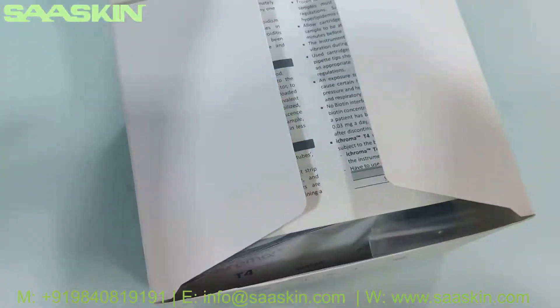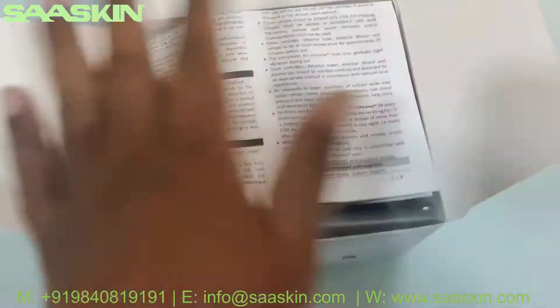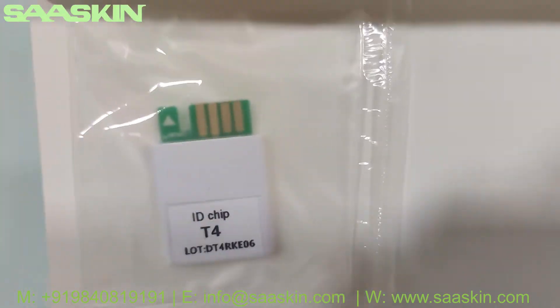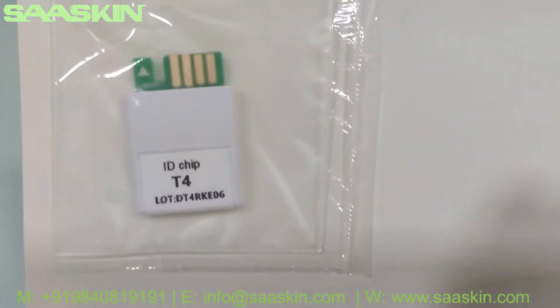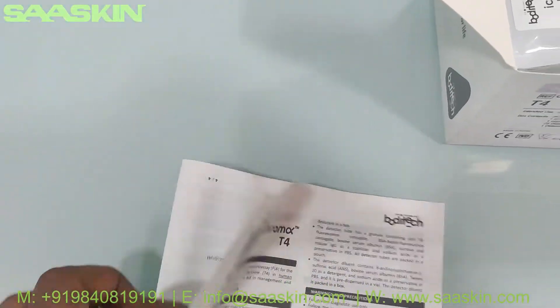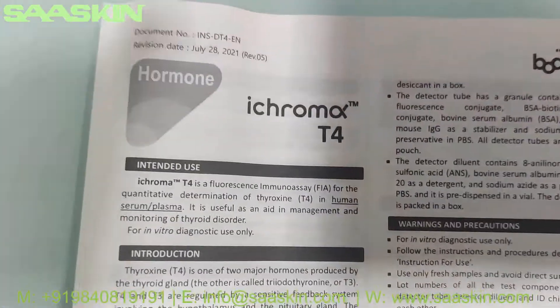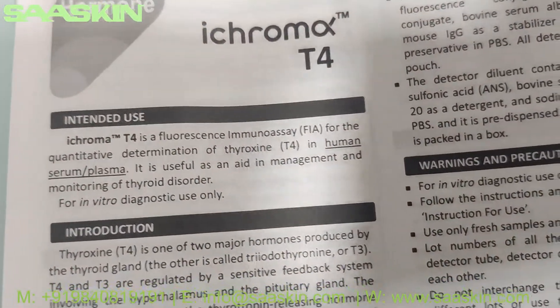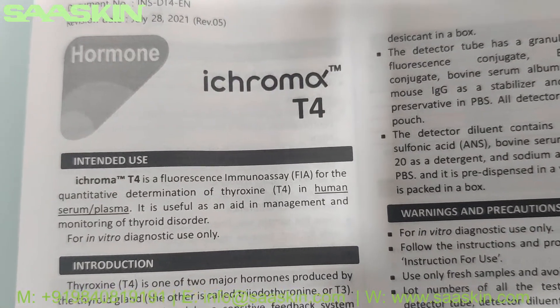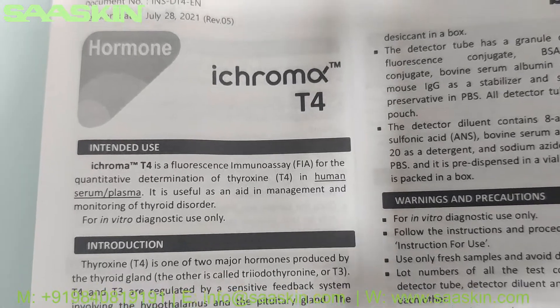Let me unbox this for you. Inside the box, this is how the inside looks like. You can see there is an ID chip for T4, and a package insert here which talks about the ICHROMA T4 Test Cartridges. It actually has the complete instructions. You can see that ICHROMA T4 is a fluorescent immunoassay for the quantitative determination of thyroxine T4 in Human Serum and Plasma.